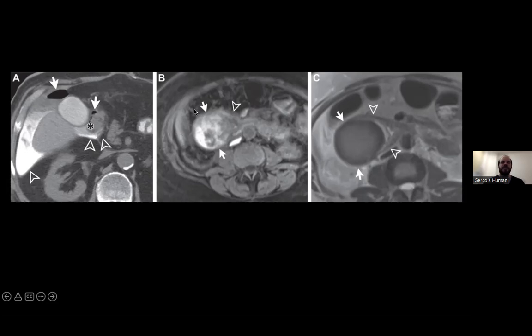In this patient, this is a big hematoma. This is a T1 image with heterogeneity, and then this is a T2 image. And one can see it's centered in the lateral wall of the duodenum. So this being the duodenum, it wraps around this region of hematoma.